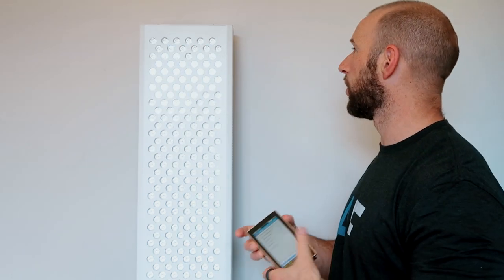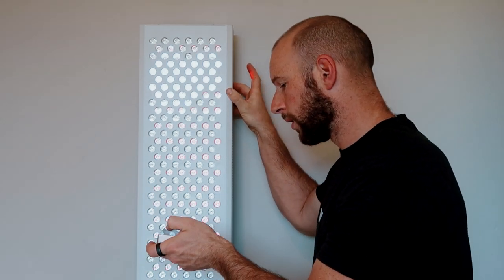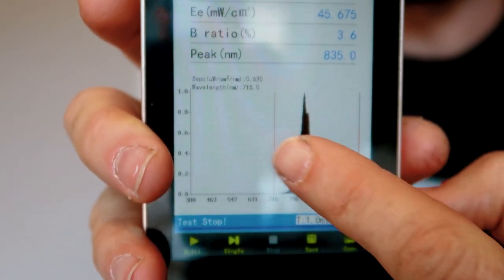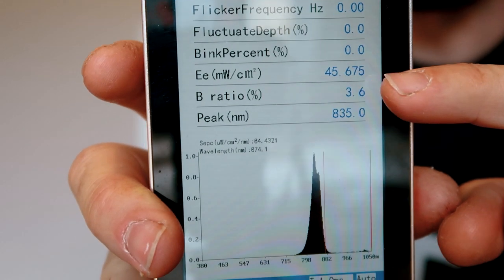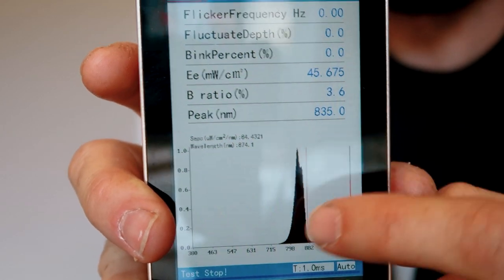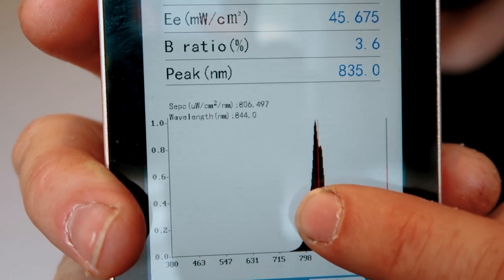I'm going to turn this on just on infrared mode and get a reading. We can see a breakdown of the light that has been emitted. Up here with the EE we can see the irradiance, peak nanometers — that shows the highest peak — and I can move across to see different wavelengths and their irradiances.